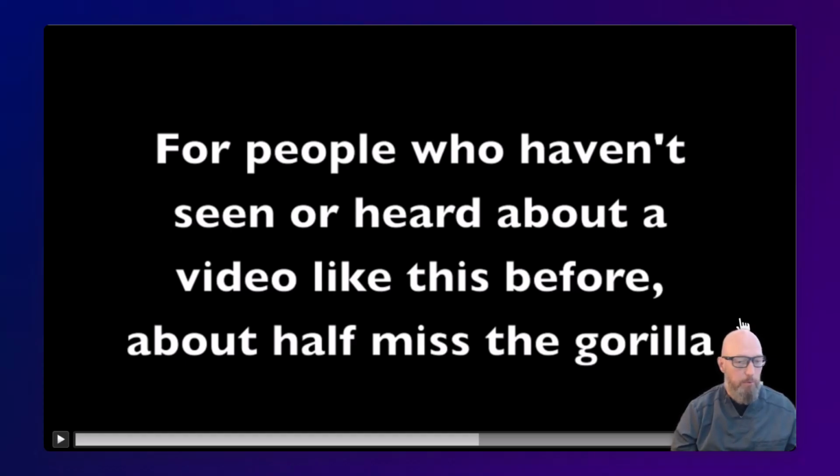And so what's the point of that in a radiology lecture? Really, it's attention to detail. When you look at a radiograph, you tend to see what you're looking at and miss everything else if you're not looking for it. Dentists do this constantly: they look at the tooth they're worried about, maybe a couple of teeth around it, and they never look at the rest of the image. The maxillary sinus, the nasal cavity, the inferior alveolar canal, the soft tissue shadows, all that stuff is on every panoramic radiograph, and unfortunately, most of it gets ignored.